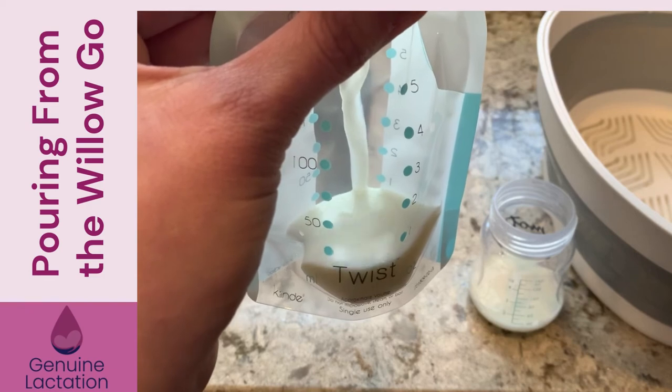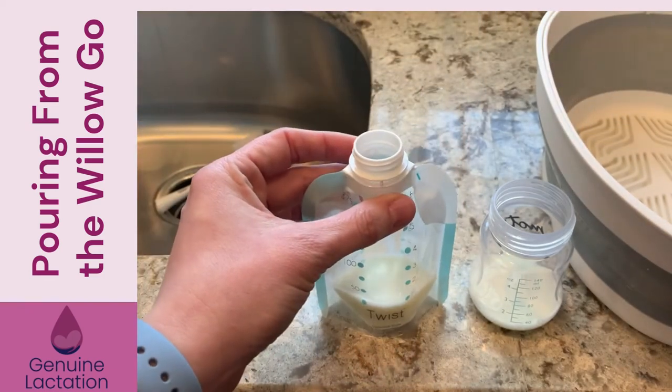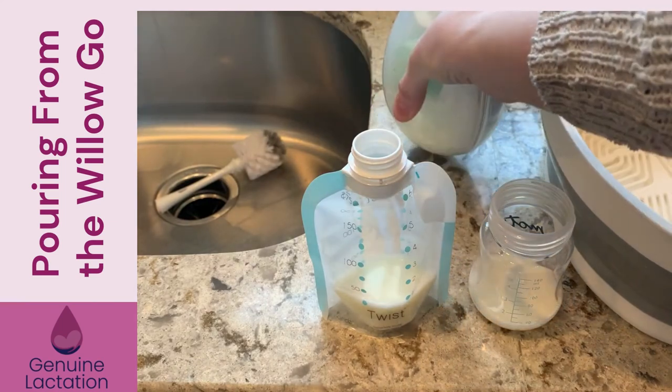So I really like that. I used to pump on the go a lot, so this would have been very handy if I was trying to empty milk into milk bags in the car.